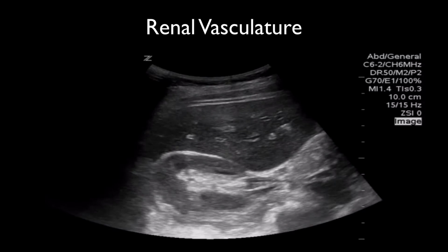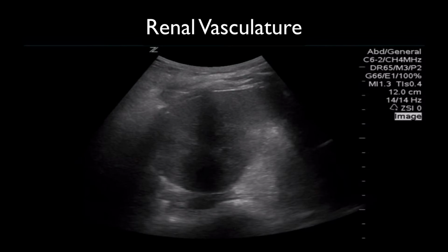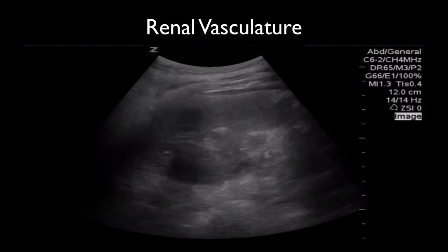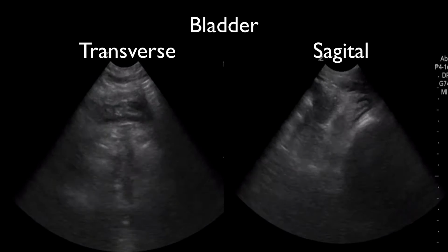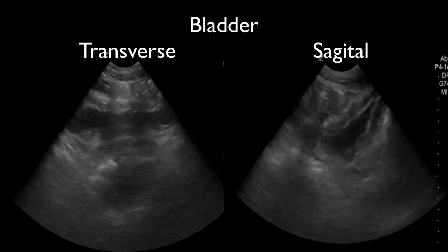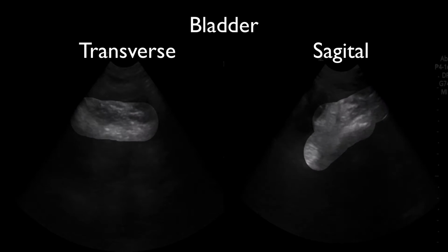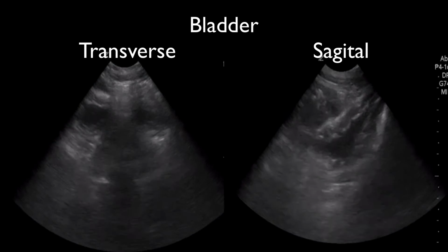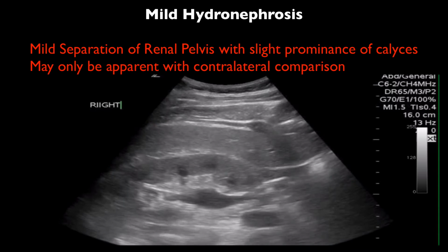That's the renal pelvis. And vasculature at times can masquerade as hydronephrosis. Putting color flow and identifying vessels can be very important. Once you've evaluated the kidney in two planes, you go to the bladder and evaluate that in two planes as well. When the bladder is decompressed, it can be challenging to find. You have to point the ultrasound beam very low in the pelvis, searching for urine, which will appear anechoic. If it is a bladder outlet obstruction, then the bladder volume is often very large, and you can measure this volume easily.